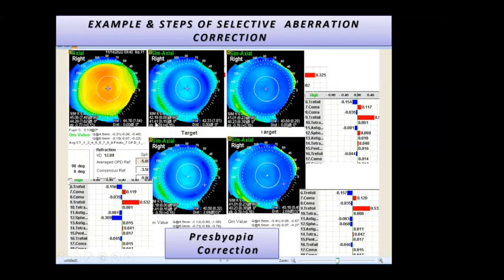Now, this is an eye, and this patient has either to correct. We corrected one eye fully. So this one eye, it is the same eye, but I'm telling you, if I do it this way, with this technique or that technique. Now, if you look at this picture here, this is 40 K, and here it was 44. So this means that I corrected between this one and this one 4 diopters. So this patient had 4 diopters of correction and the big treatment zone, everything looks beautiful.